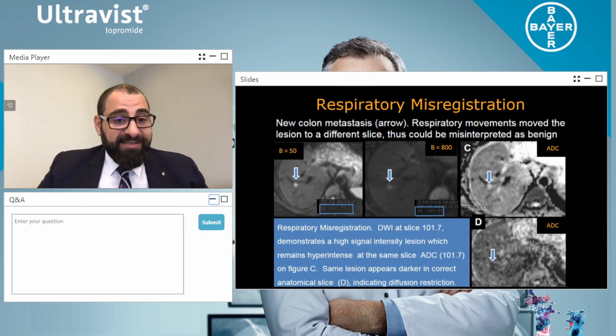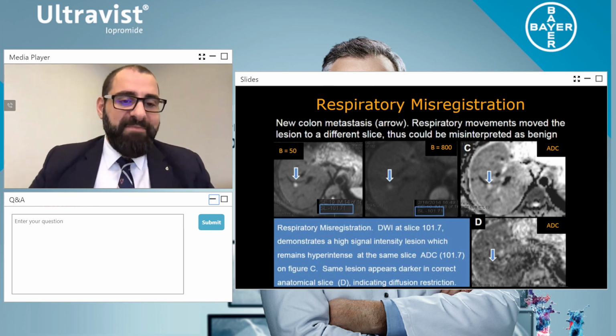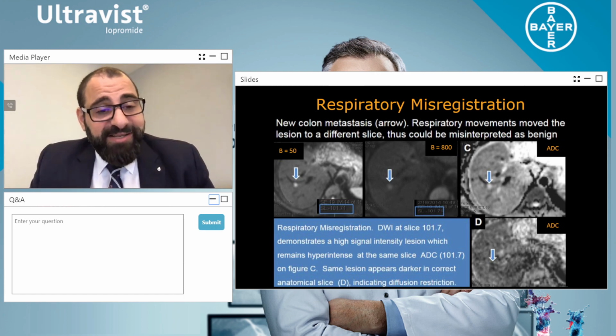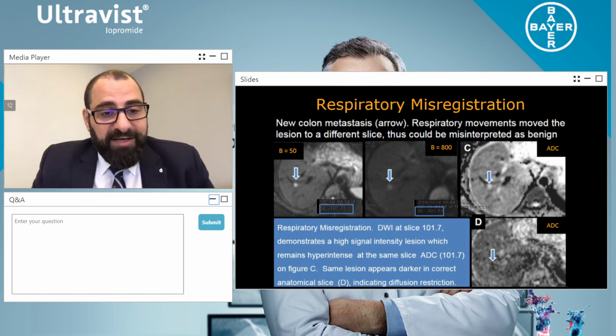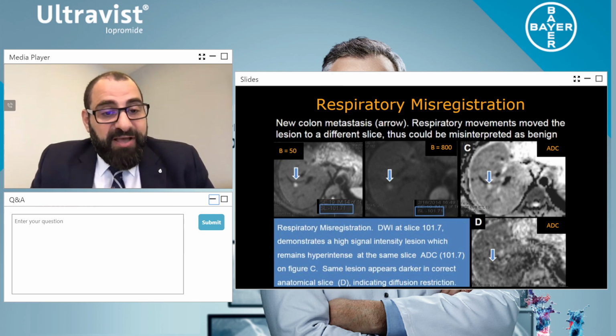Now, I had another excellent question from Vanessa Malara. Thank you. Do you see a difference in enhancement between women and men? Well, fantastic question. I actually see a difference in enhancement based on the physiology of the liver. Do you have a fatty liver? Are you a large patient? Are you a thin patient? Do you potentially have thalassemia?